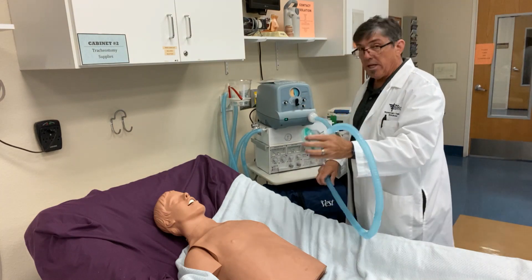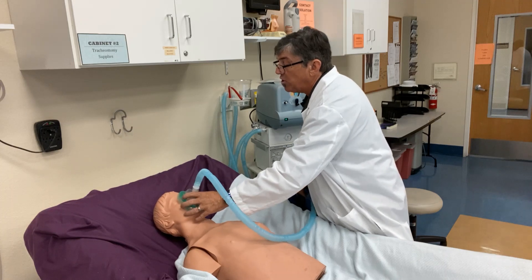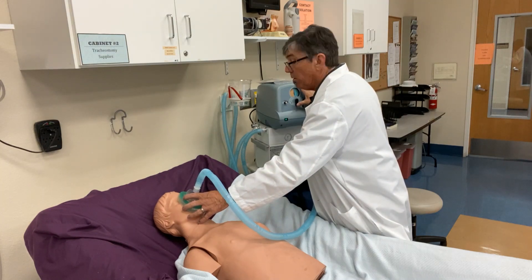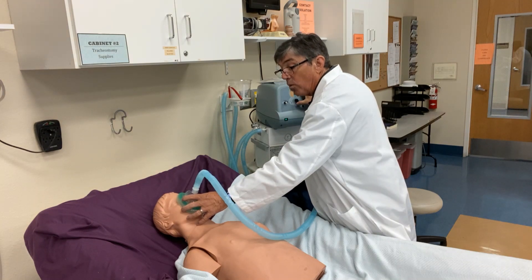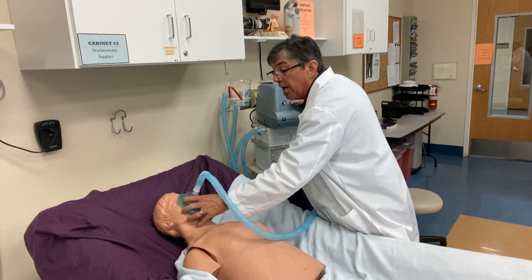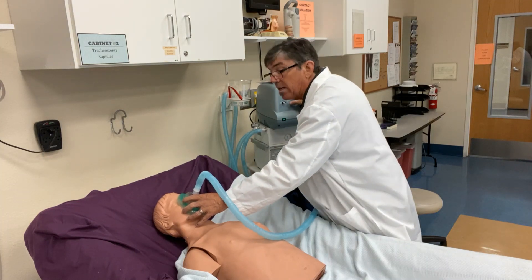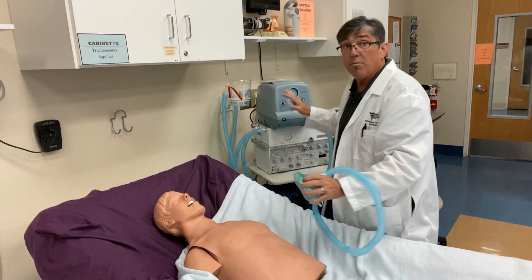So let's go ahead and place the mask on our patient here, nice and tight. We're going to instruct the patient on what we're doing. You watch the patient breathe and get in sync with them. When the patient's ready to inhale, you toggle the switch over to inhale, and then toggle it back on exhalation — that's usually when you're going to get your cough. Then back to inspiration, have them take another big breath in, and switch the toggle back to exhalation. It draws the breath back out, and then they usually will have a big cough.